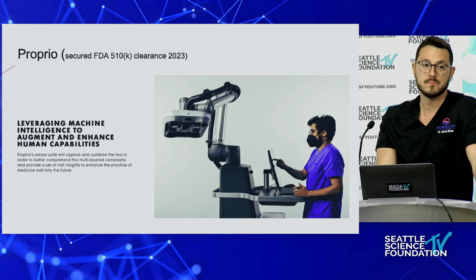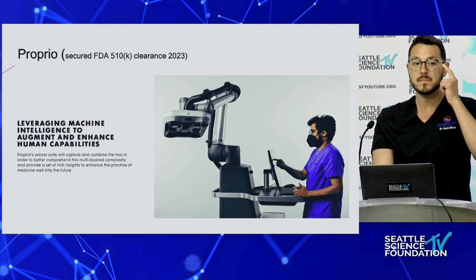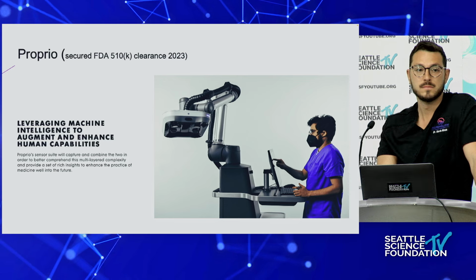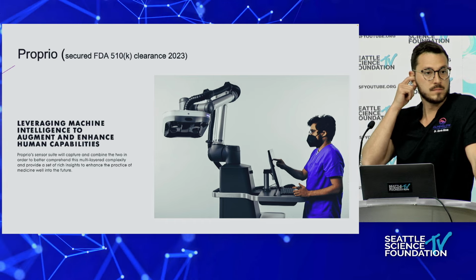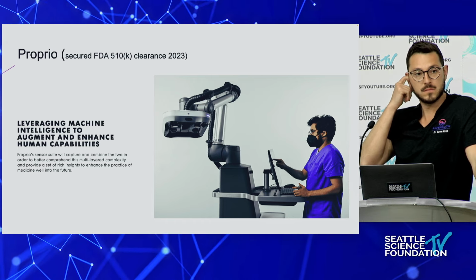I know that in some academic centers, they do actually use O-arm navigation for vertebral augmentation. But for me, that was what I went through on that learning journey and discovered. So I wonder if they can get the costs down. Because I think we're talking about O-arm for mapping, and then using this overlay, just like for spine surgery. Putting in pedicle screws pays pretty good. Sure, so there's more margin than with my little procedure.